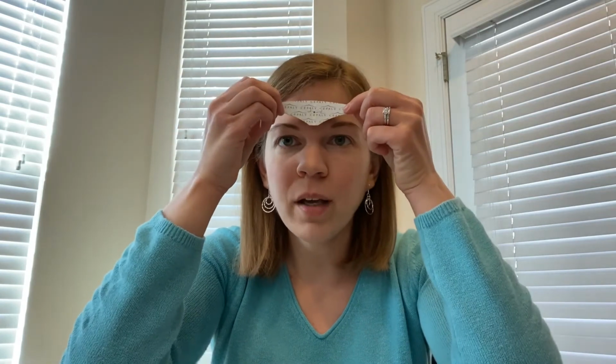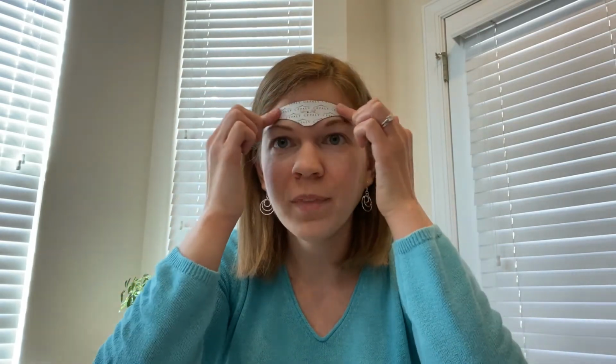Okay, let me show you how the CEFALY works. The first thing you're going to do is peel off the electrode from this little plastic sheet it comes on. So you're just going to peel this off. The back of this is sticky. So you just peel it off and you're going to stick it right to the middle of your forehead, like that. Now let me lean in a little bit.